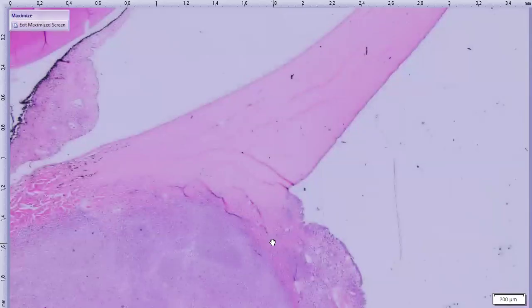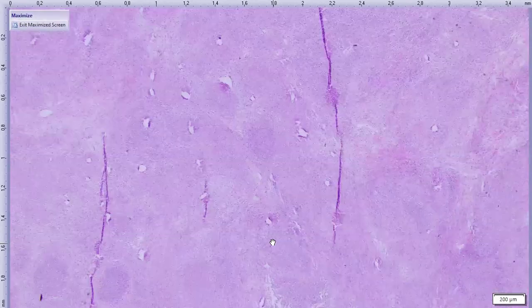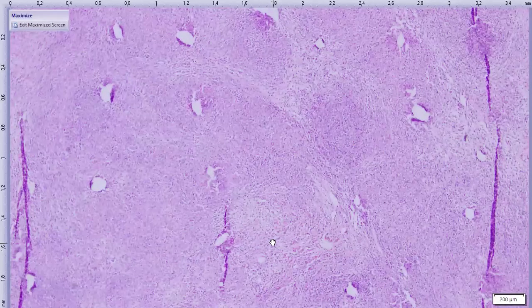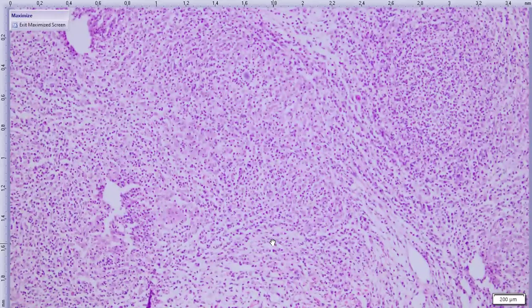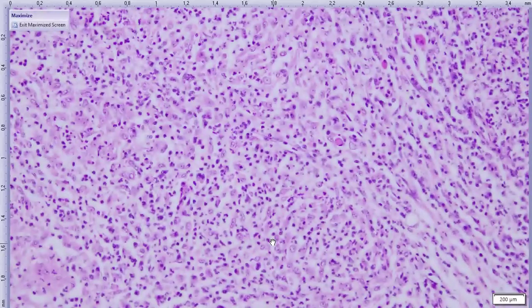So we have a very purple, cell-dense infiltrate, which is where that tan mass was grossly, involving the conjunctiva, sclera, episclera, orbital connective tissue, and breaking into the adjacent uvea, just like we saw in gross. The cornea is now on our right, and the mass is below us. All that creates mass effect, but it is not neoplasia, because as we drop in closer, this infiltrate is inflammatory.